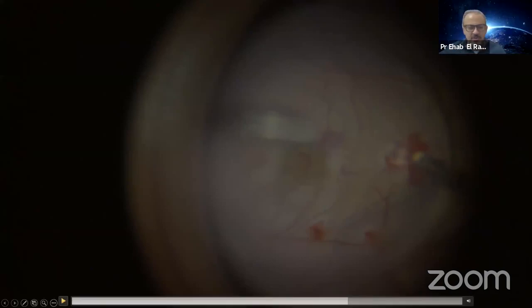Abdullah, would you do something different? Actually, in the area where the ILM is already peeled, I would leave it. It rarely gets detached whenever you have a small tear, especially on the posterior pole or around the macula.